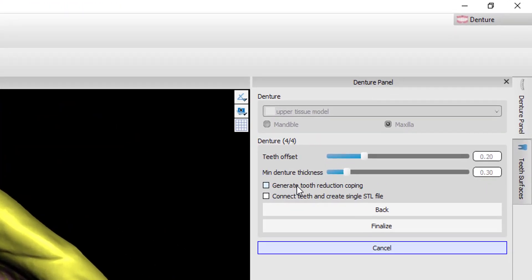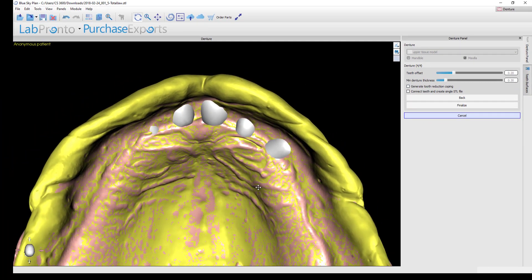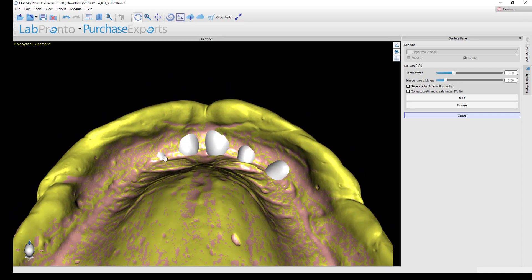You have the option to generate a tooth reduction coping, which you should only check on if you are using physical denture tooth sets — the Nobilium teeth in the software. If teeth are impinging into the model using physical tooth sets, as is often the case with a conventional denture, those teeth have to be trimmed. The software can generate a tooth reduction coping as an additional printable file, allowing you to insert physical denture teeth into it and trim anything sticking out the bottom.